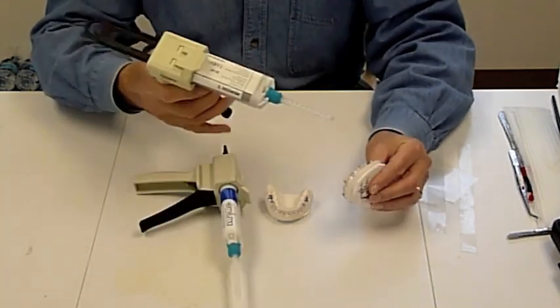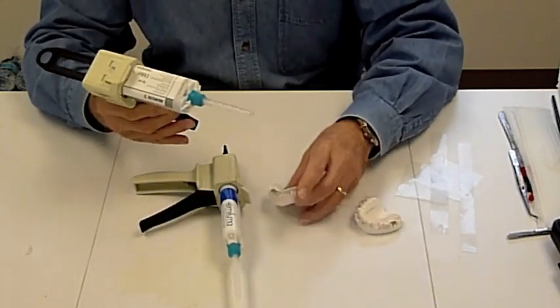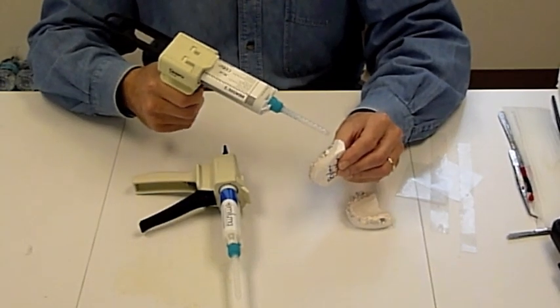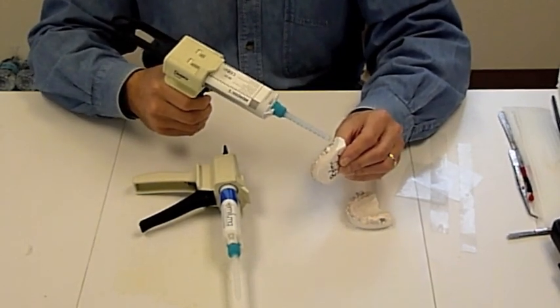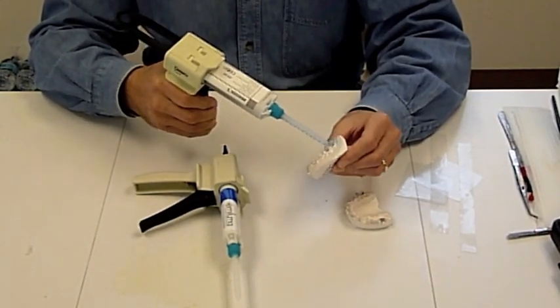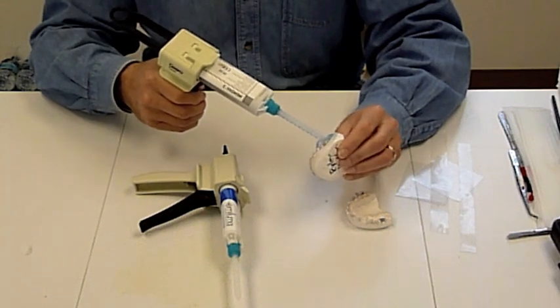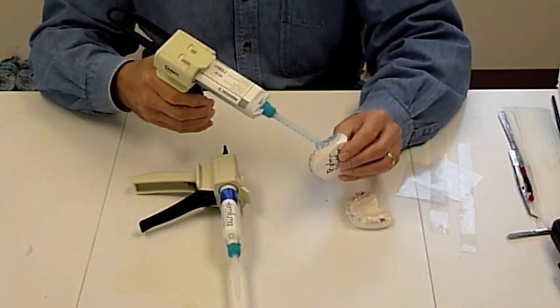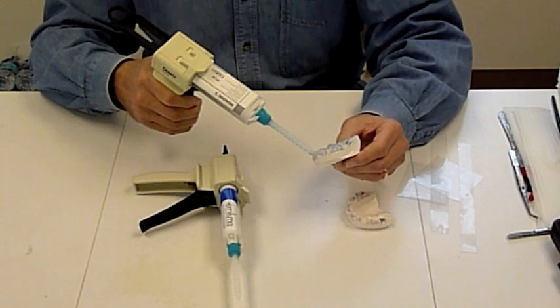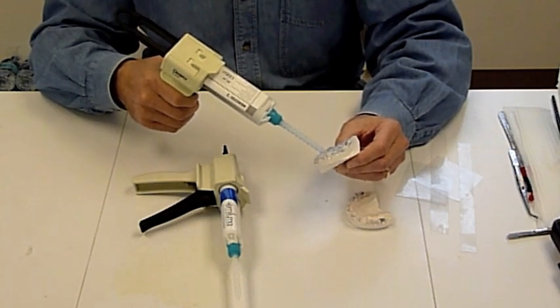We'll use the memosil to cover the occlusal surface and the rest of the buccal, creating the bulk of the tray and our positive occlusal stops.